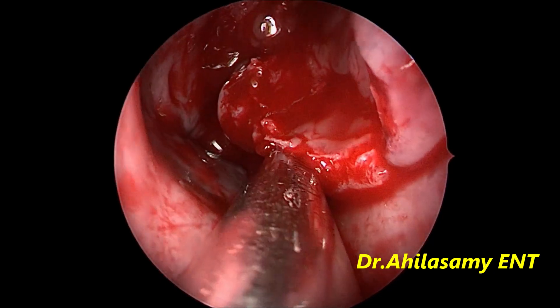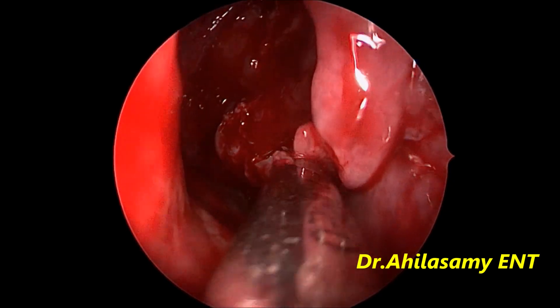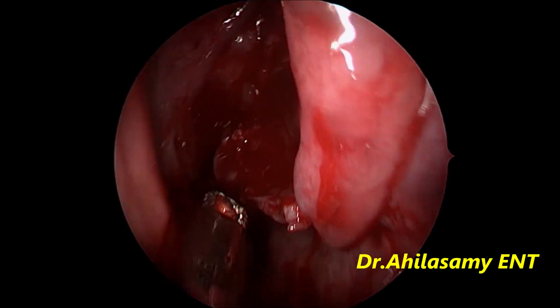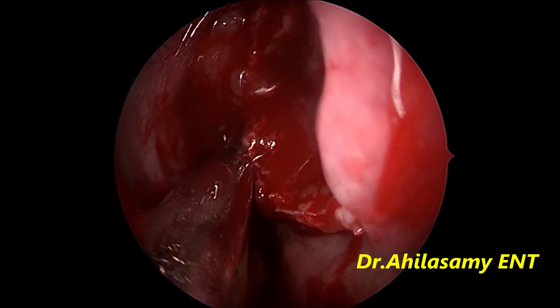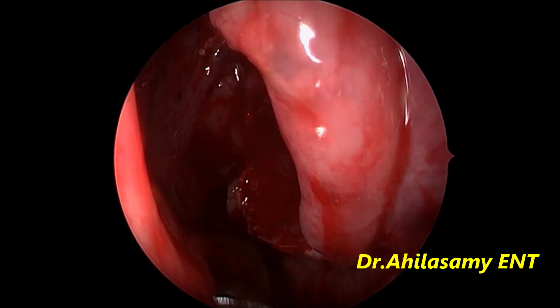This video is mainly shown to demonstrate the very rare occurrence of a polyp arising from the middle turbinate — specifically from the cavity of the concha bullosa — coming through an unnatural accessory ostium in the anterior part. Thank you very much.